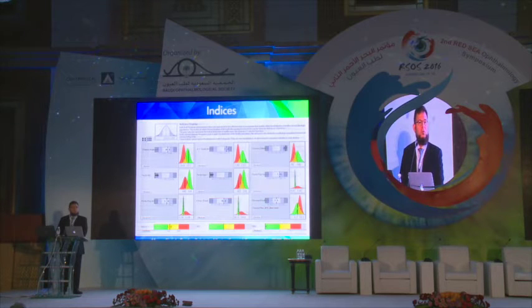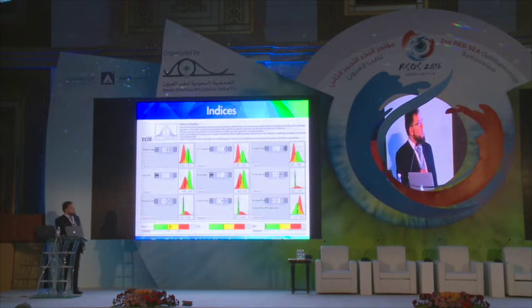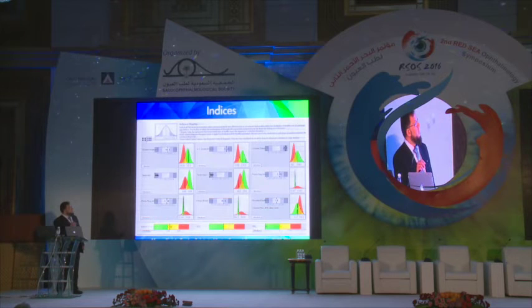We have to depend on our subjective estimation of the cornea, because if we depend on the diagnosis the machine gives, it is as if we are depending on autorefractometer to prescribe glasses, which is not correct. So whenever you see these indices, you can take an idea. And even the manufacturer recommended that it is just to pay attention, but you should not depend on it for diagnosis.